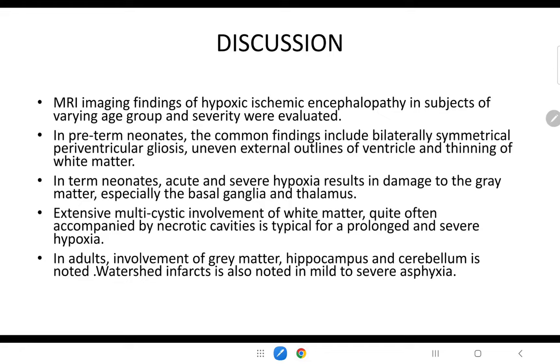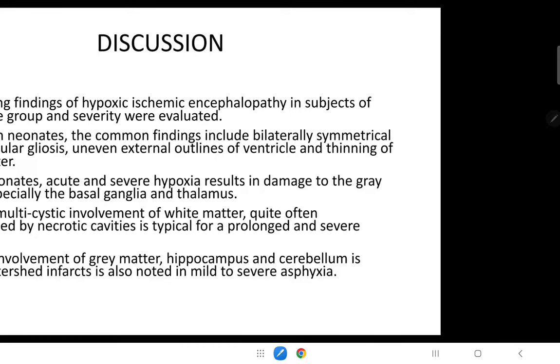Discussion. MRI findings of HIE in subjects of varying age group and severity were evaluated. In preterm neonates, common findings include bilateral symmetrical periventricular gliosis and thinning of white matter. In term neonates, acute and severe hypoxia results in damage to the basal ganglia and thalamus, with multicystic white matter involvement typical of prolonged severe hypoxia. In adults, involvement of grey matter, hippocampus, and cerebellum is noted, and watershed infarcts are seen in mild to severe asphyxia cases.